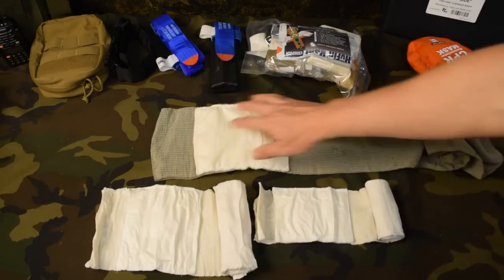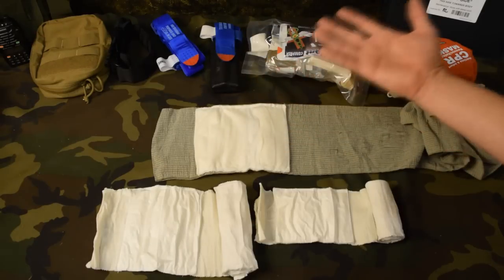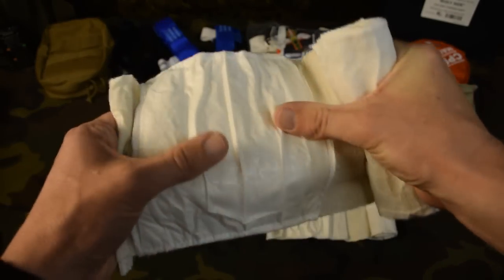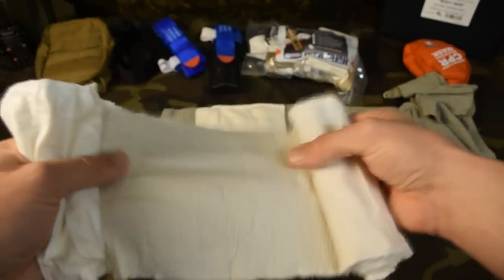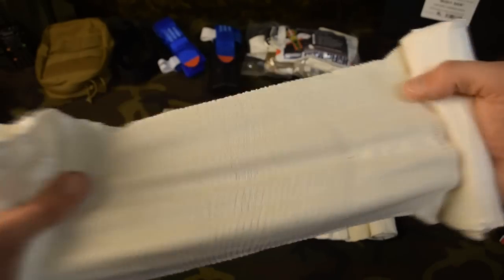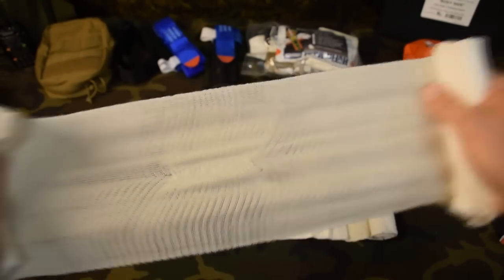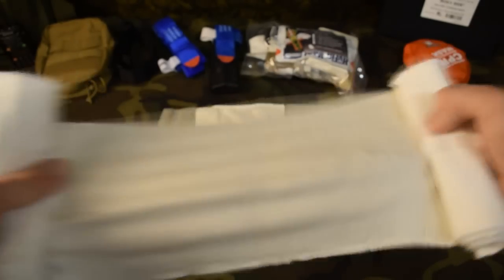As I roll the Israeli bandage here, you can see this is the area where we put the wound and then wrap it to create pressure. Pressure bandage, trauma bandage — this is what these are called. This rolls out and this is the stretching material. As you wrap it around the wound and the extremity, you pull it tight, and that's what creates the pressure so you don't have to hold it with your hand. You can generate a lot of pressure by wrapping it, pulling it, then wrapping and pulling again.